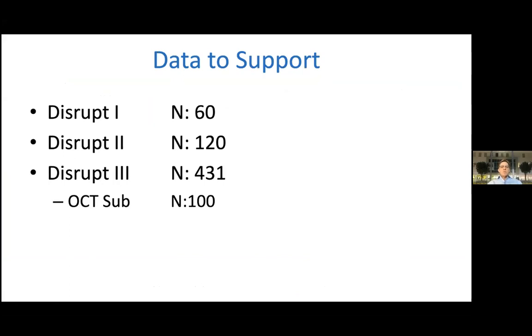So what are the data to support the use of Shockwave? If you think about it, it's very difficult. What is there to prove? If you use cases that are incredibly difficult, then you can only compare it maybe to the rotablator. But then our indication for use would be difficult, as we can discuss at the end, because I use the rotablator in circumferential calcium where I might not even get my balloon in, whereas the rotablator would be useless in not circumferential calcium in bigger arteries. It's very difficult to really make a case for making data for the usage.